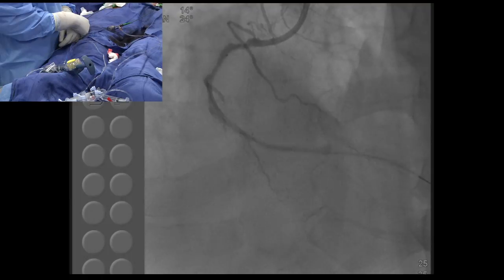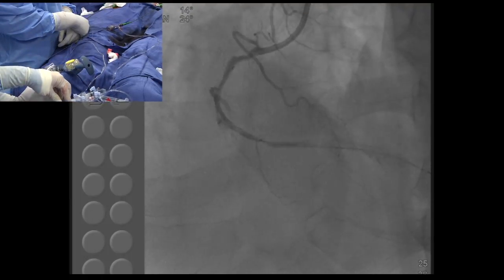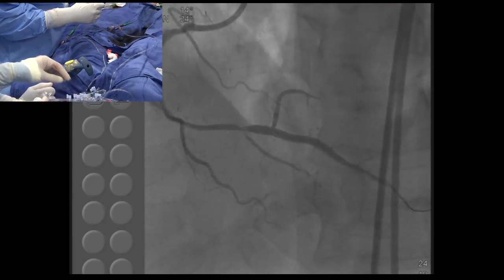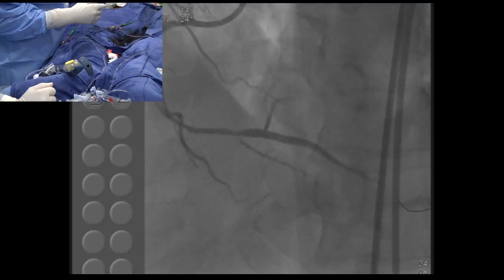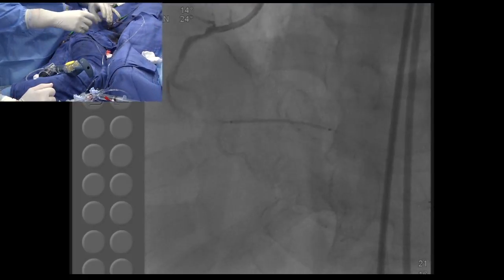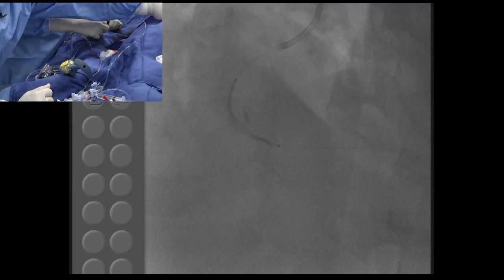And you feel comfortable with the overlapped 3.5? No, it's too big. Yeah, too big. Yeah, but low pressure, I mean, you don't have to worry about. See, then now you have to go all the way there because that's where the disease was. Now, it always happens with these patients that they get quite long. Yeah, now it's too far.